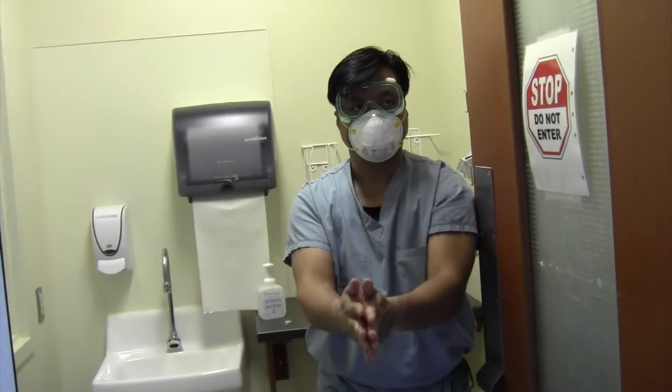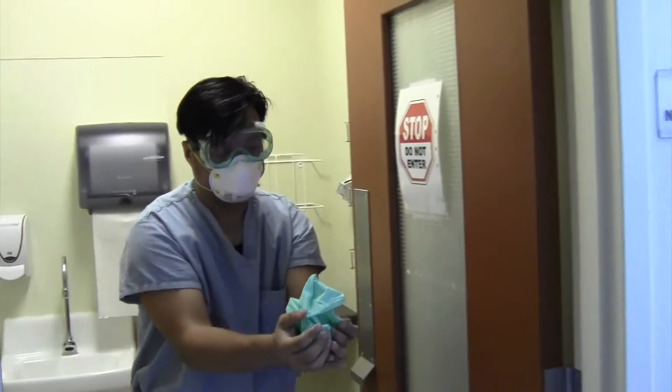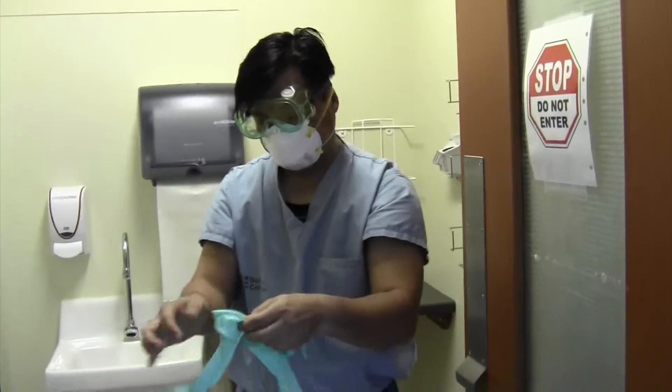Step 12: Put on a new pair of gloves. The observer assists by handing the clinician a pair of gloves ready to use.